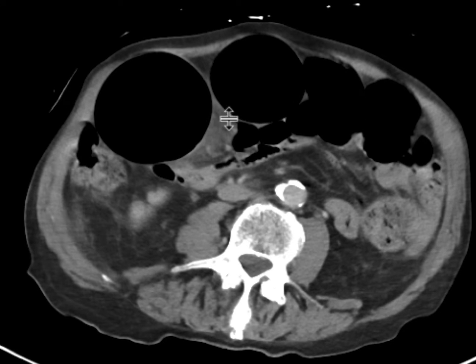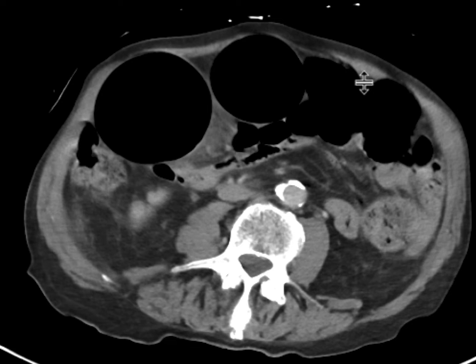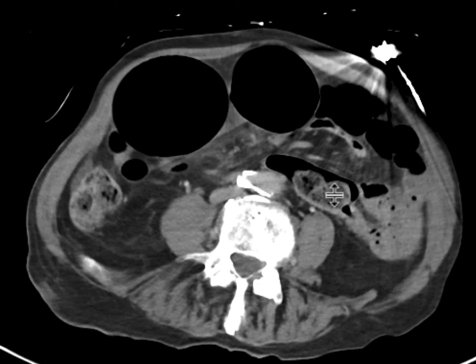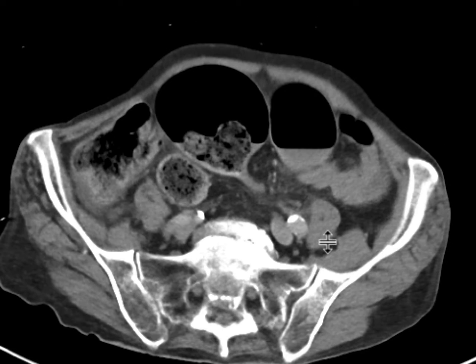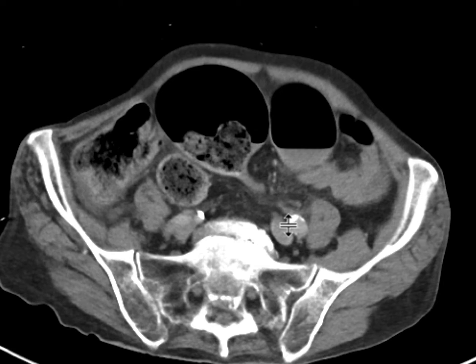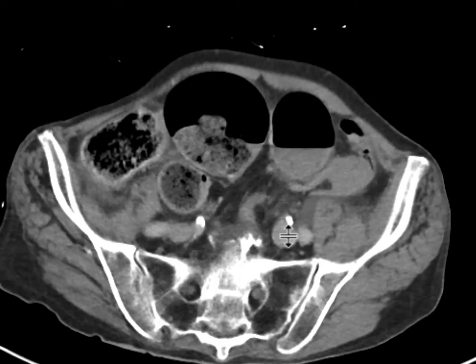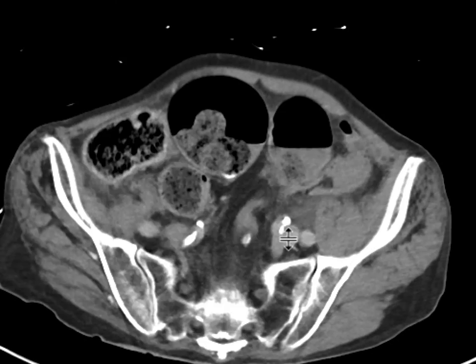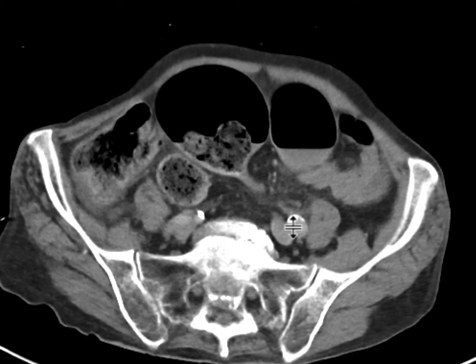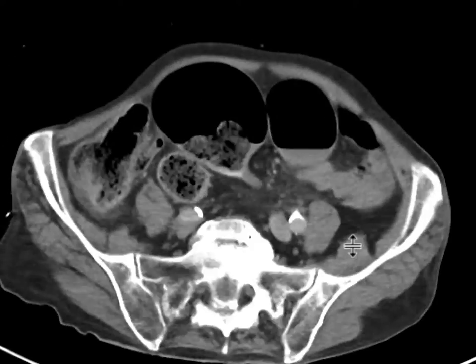There's a little bit of interloop edema and fluid, suggesting a high-grade obstructive process that's brewing. Following this loop down, you can see a very abrupt change of caliber — this loop is very distended — transitioning to this collapsed loop of the sigmoid colon, giving that bird's beak appearance seen with sigmoid volvulus.